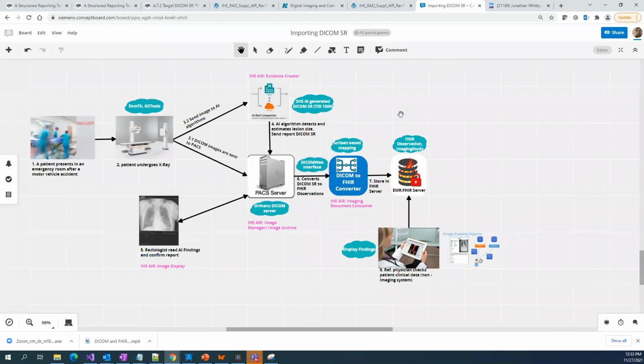Another part I want to collaborate on is the ABDM track. On the ABDM track, we have the health information provider and health information user. If you go into detail on the profiles ABDM has provided right now, it is all about embedding thumbnails or images inside the report. There is no clear definition on how you are going to extract these images from a PACS server and provide means to view those images on any of the clinical systems as well.